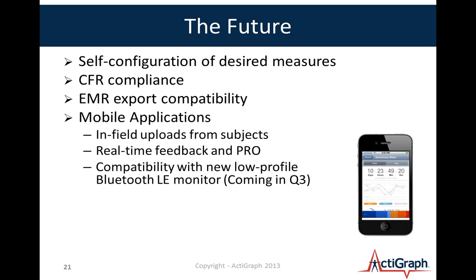We're working now and have a prototype of a mobile application that allows in-field uploads from subjects. You'll notice on the third bullet there that this system will be compatible with our new low-profile Bluetooth low-energy monitor, which is coming in Q3 of this year. And so the idea is we would offer an iPhone app initially that would capture data from patients in the field in near real time and upload that data wirelessly through the mobile device up to the system periodically throughout the day as the user is prompted to do so, and also provide some feedback to them through the application, maybe about their progress, or maybe asking some questions about their daily activities through patient-reported outcome data capture. So we want to offer that option as well, and that's something that we've been hearing a lot about, and so we've got resources today that are working to make that happen.